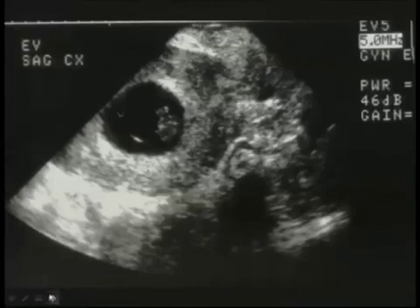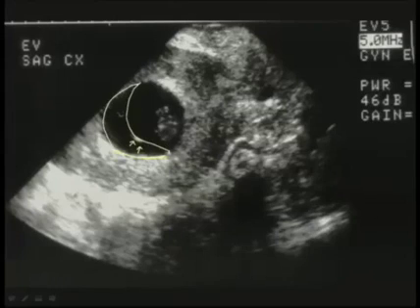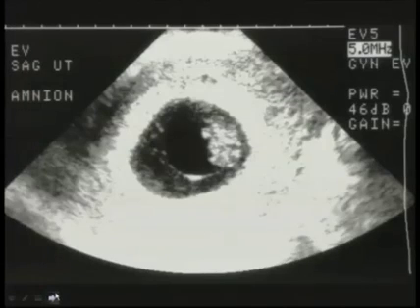Now, one caveat about making that diagnosis is that in normal pregnancy, if you see the amnion here, until that amnion is contiguous with the chorion, which is going to be back here, you'll have a space. It's called the chorioamniotic space here. And at most gain settings at which we scan, this looks anechoic. If, however, you were to turn up the gain level, and here I've done it to an unreasonable degree, you will actually see low-level echoes within this chorioamniotic space, and that is normal. There's a jelly-like substance that fills this space, and it will give low-level echoes normally, so do not mistake that for subchorionic hemorrhage.